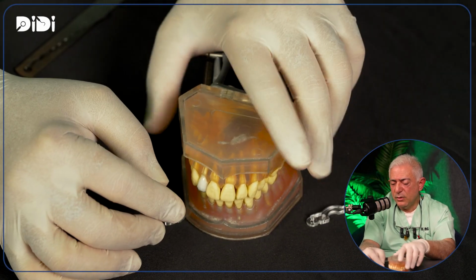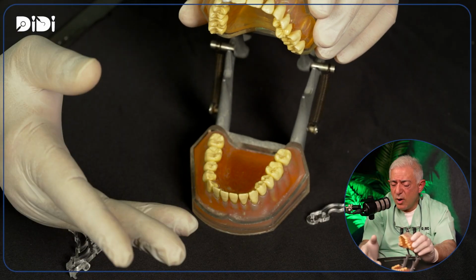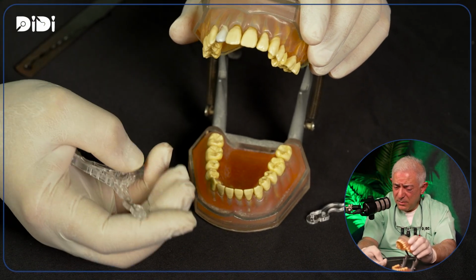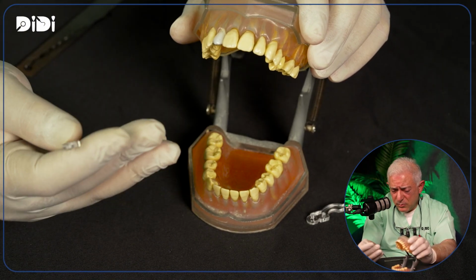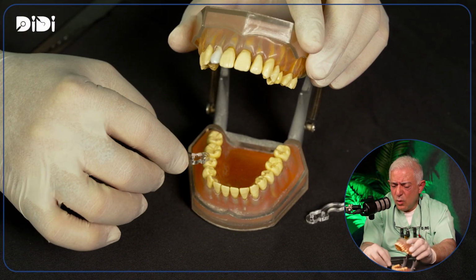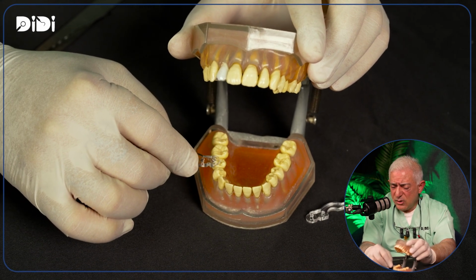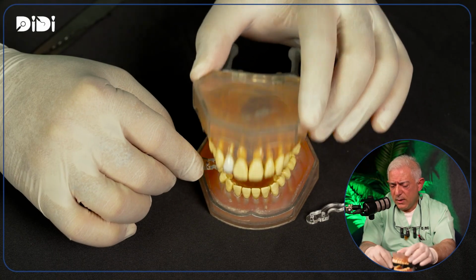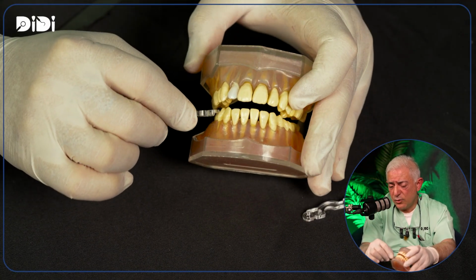You might be able to place composite and wax, and that's also possible. But in terms of time, cost, and material, this always gives you a constant, same dimension, accurate all the time. That's why we are very much using this on a routine basis.